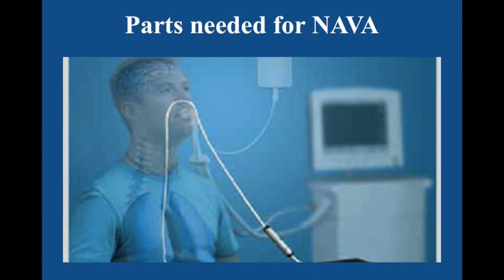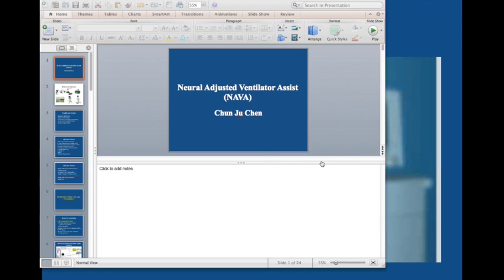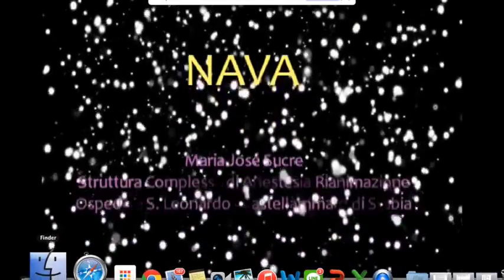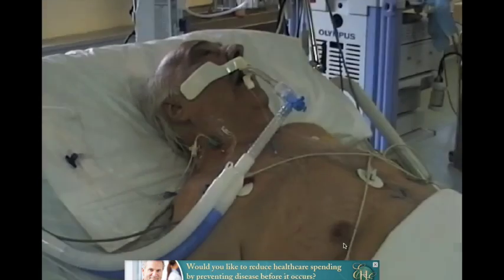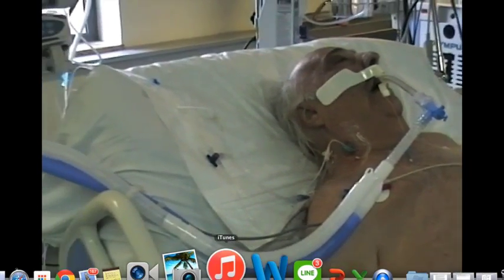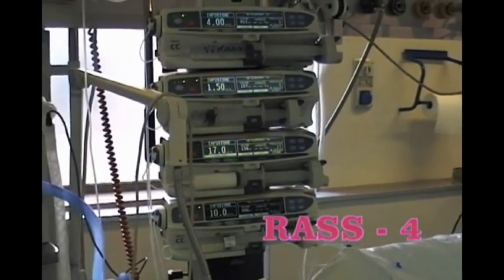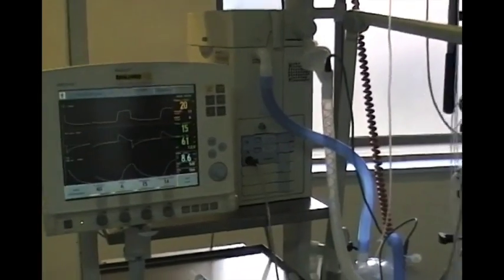And when we put in the NAVA catheter, we can still provide normal feeding. Let's look at the video. The video will show the equipment we need for NAVA, how to put the device on the patient, and how to measure the NAVA signal.